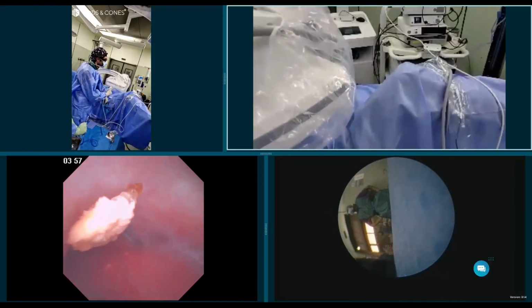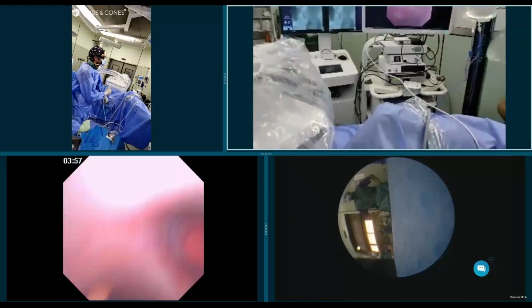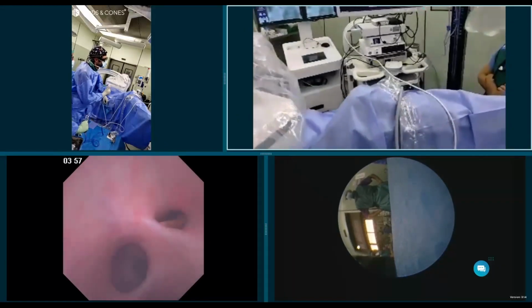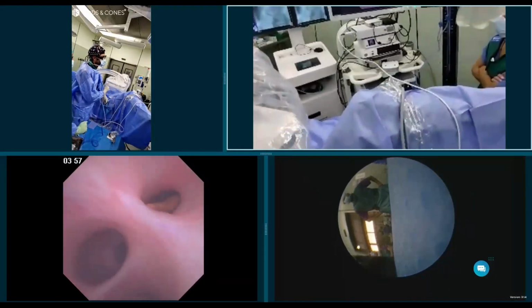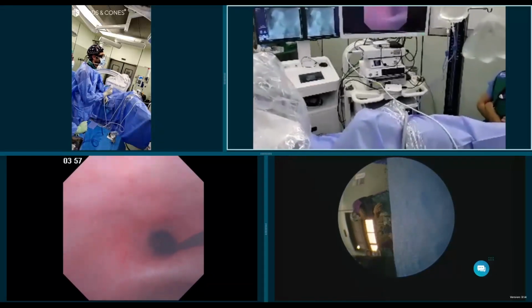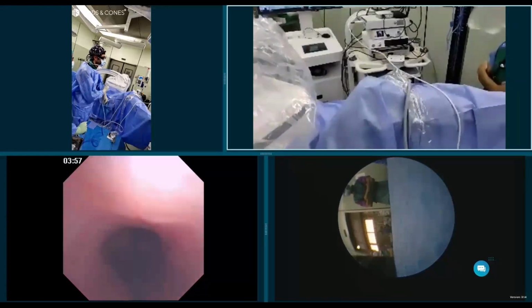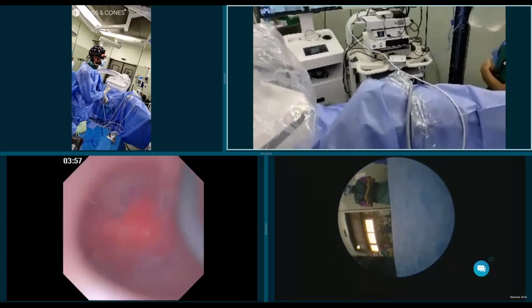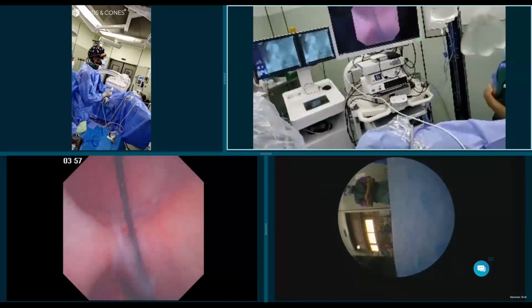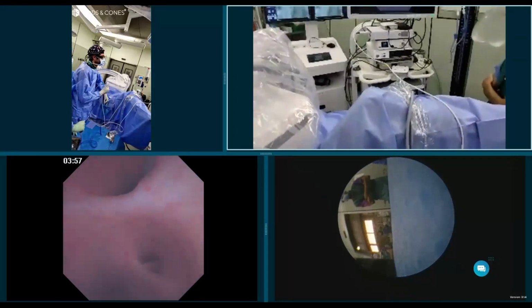Inferior calyx here, mid calyx. This kidney is like most kidneys, 60% of kidneys, with a big lower calyx. You can see here the stent, and a big upper calyx. There's no mid calyx, like 60% of the kidneys. So we have this upper pole. The guide wire is coiling, so excellent.